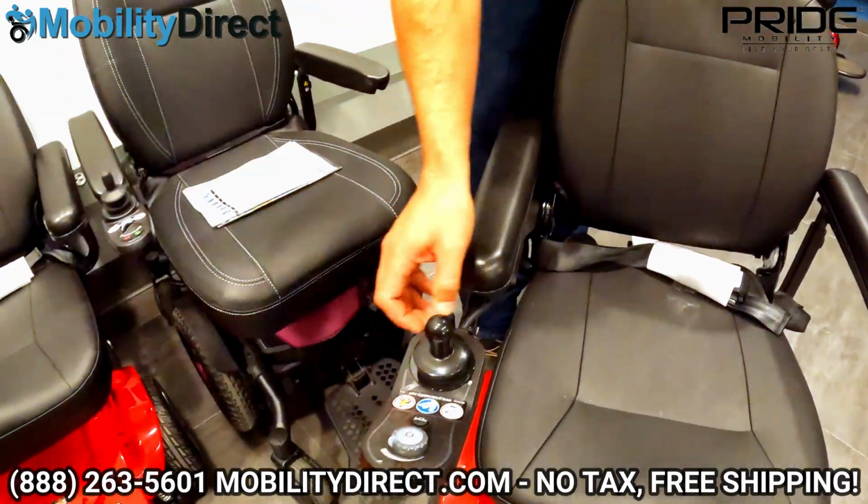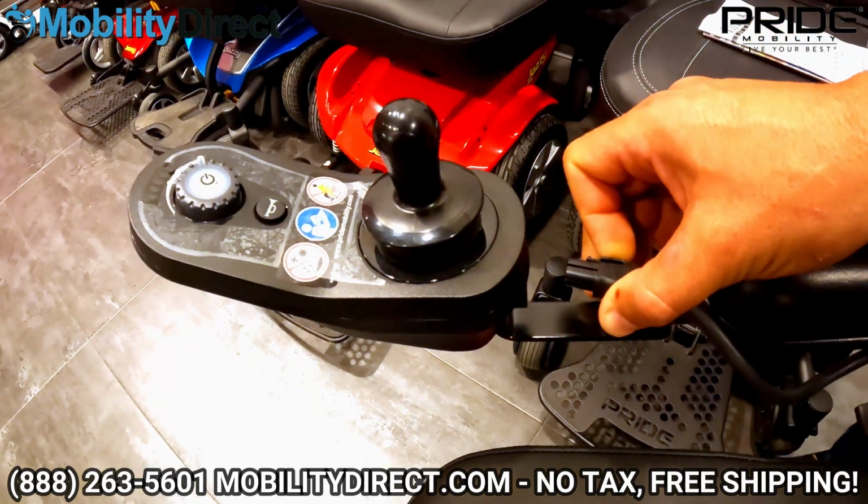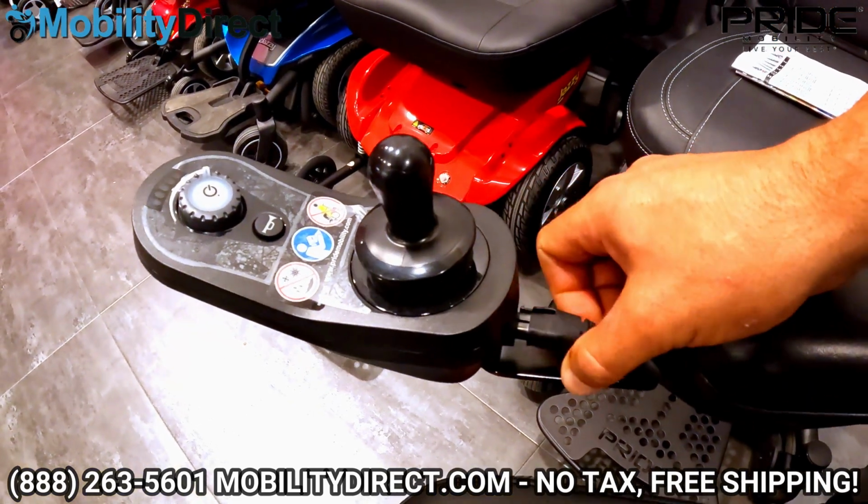Now if you want to disconnect the power when you're removing the seat, you can do so right here. And that's how you disconnect the joystick.